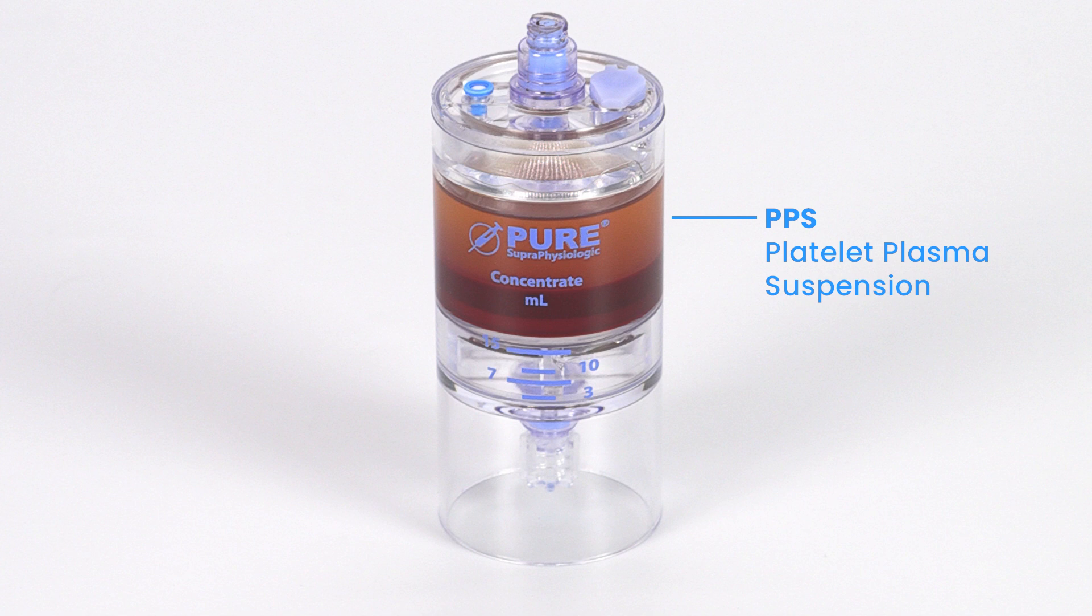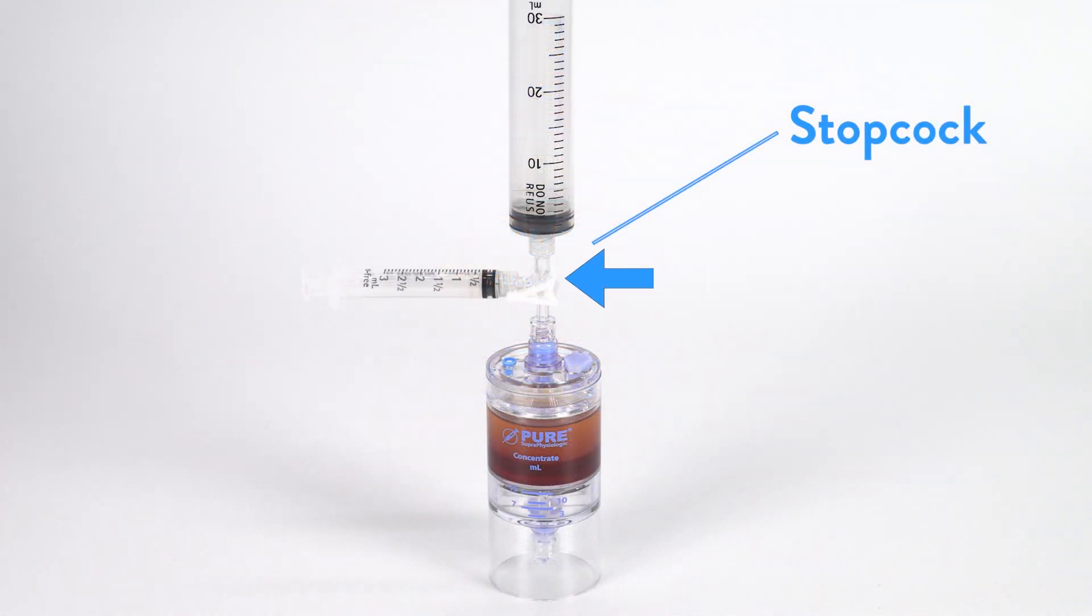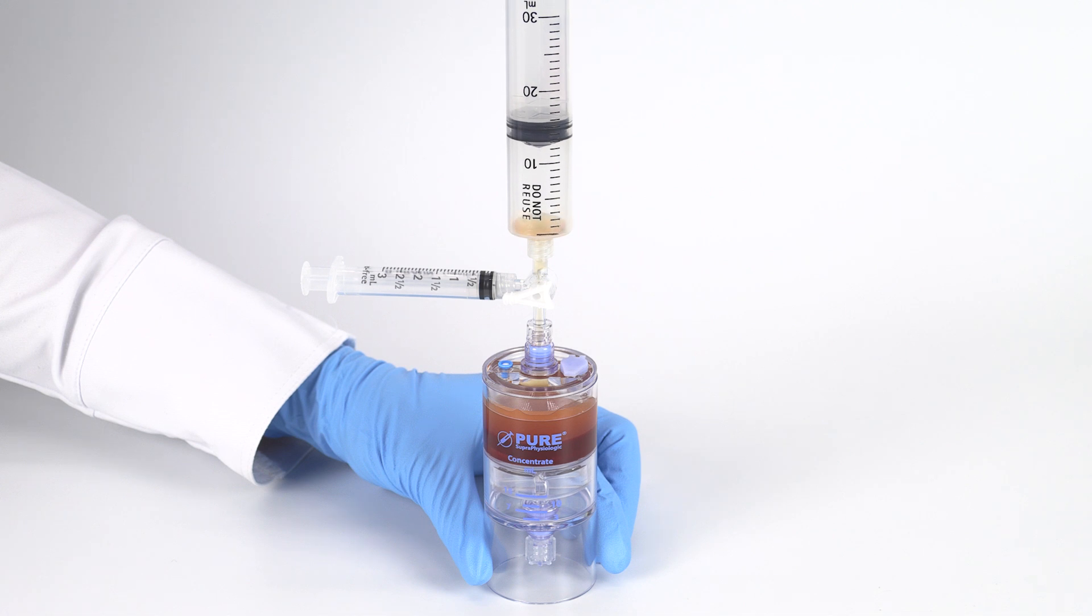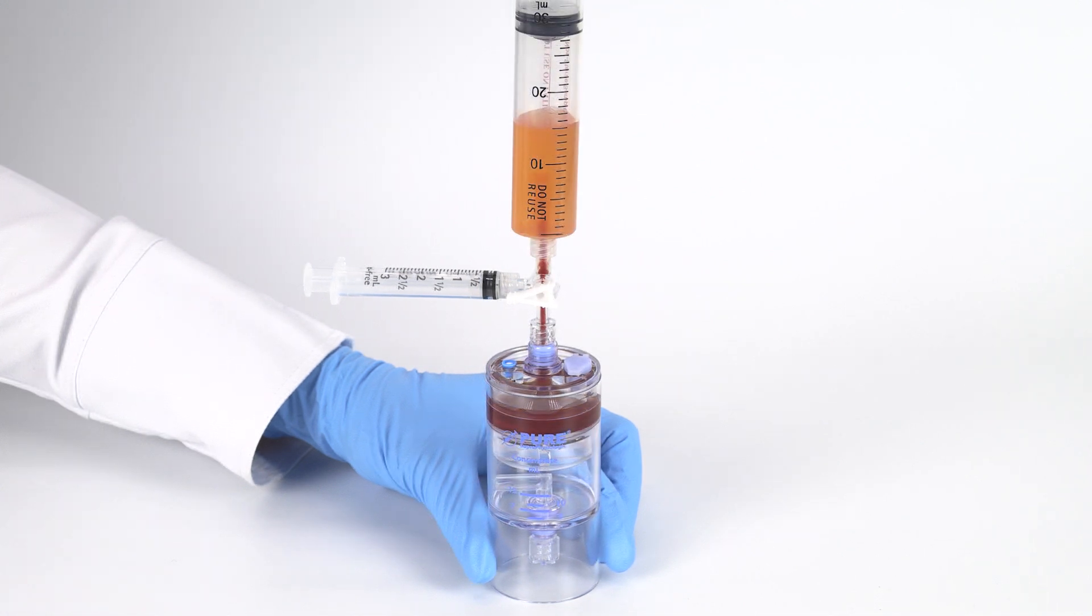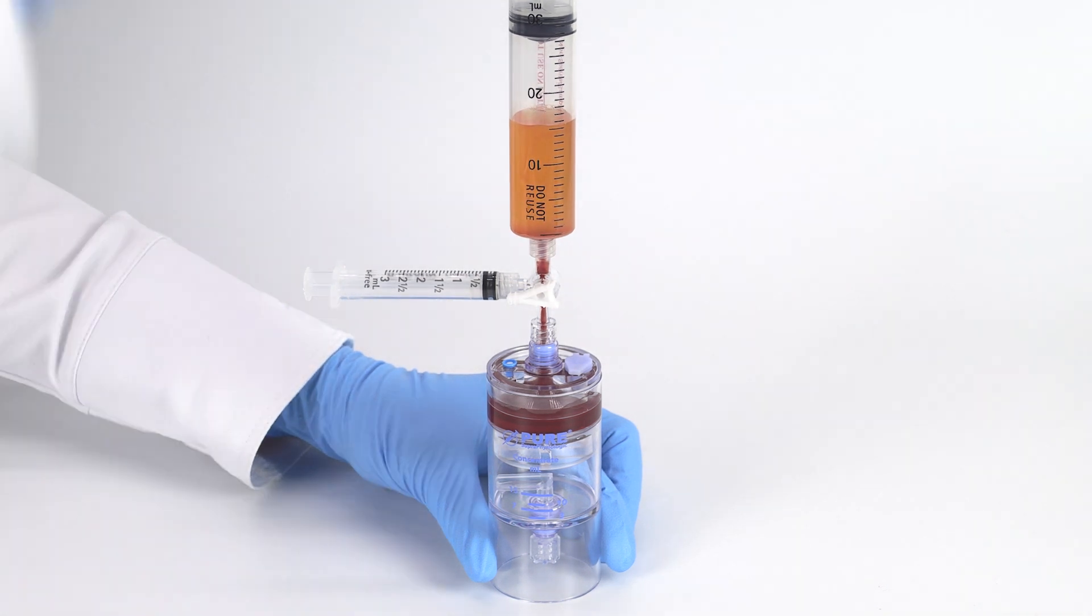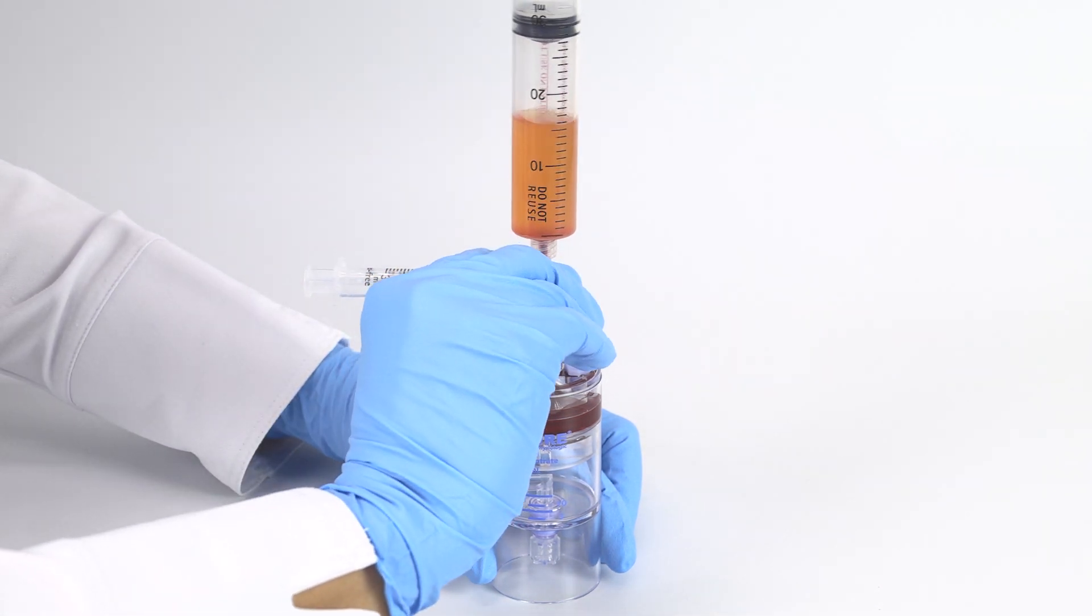After centrifugation, attach the sterile syringe accessory to the needleless port and aspirate the bone marrow plasma suspension. Then, open the stopcock to the 3-milliliter syringe and aspirate 1-milliliter of bone marrow red blood cells.